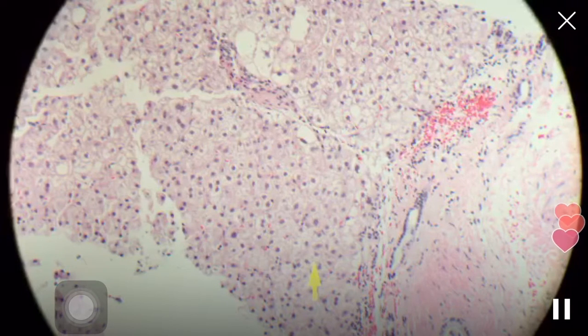And I have been fooled on biopsies where I thought, this certainly is a patient who was drinking. And it wasn't. It was a patient who was diabetic. But in this patient, for some reason, the changes were of steatohepatitis and were so extravagant. It smelled to me like alcohol, but it wasn't. Flip side, you just can't distinguish them.